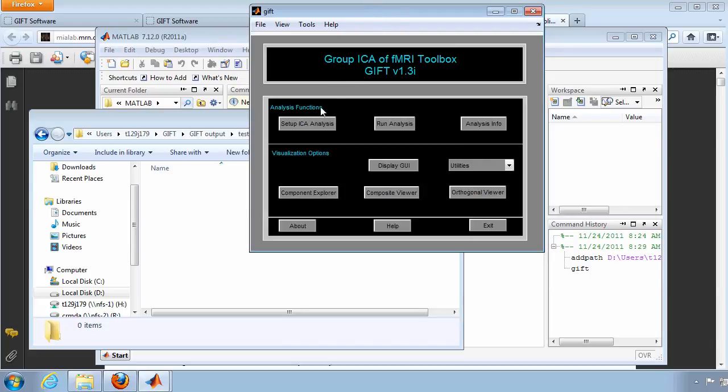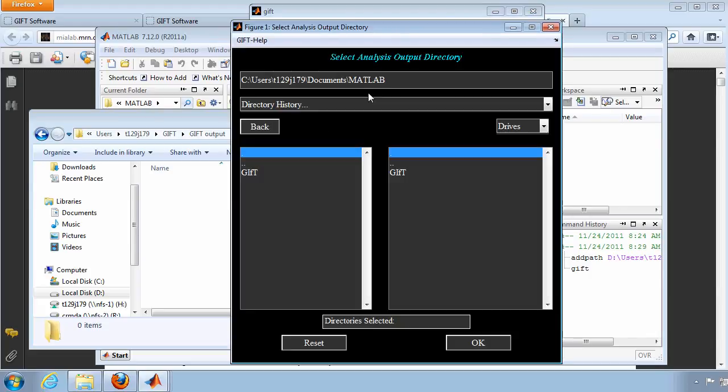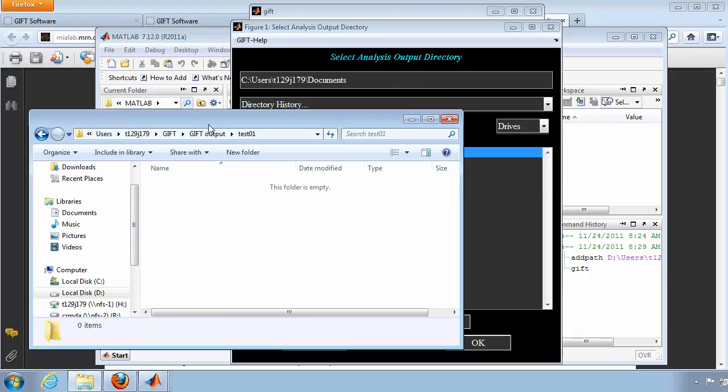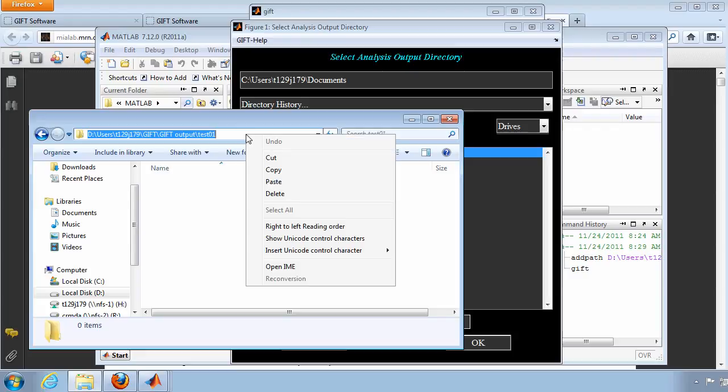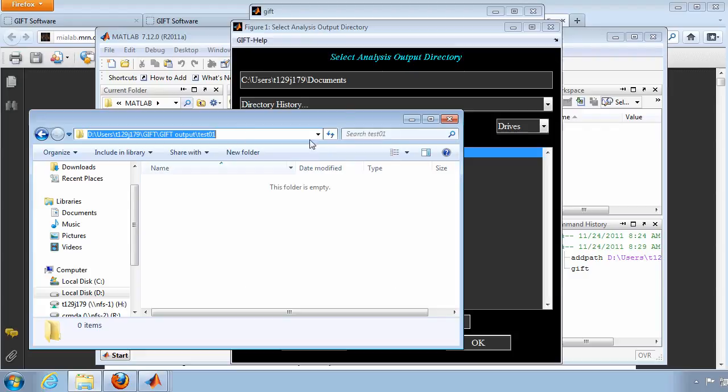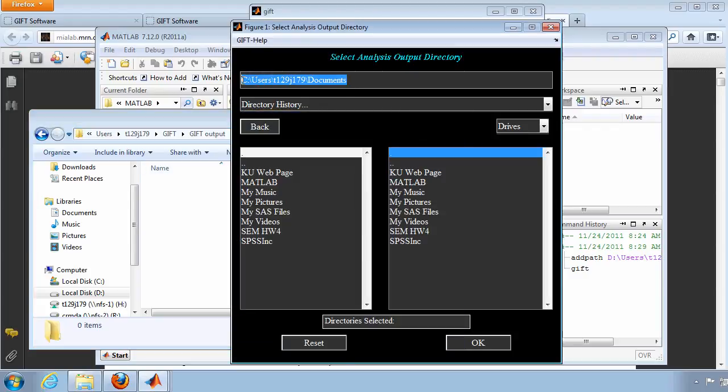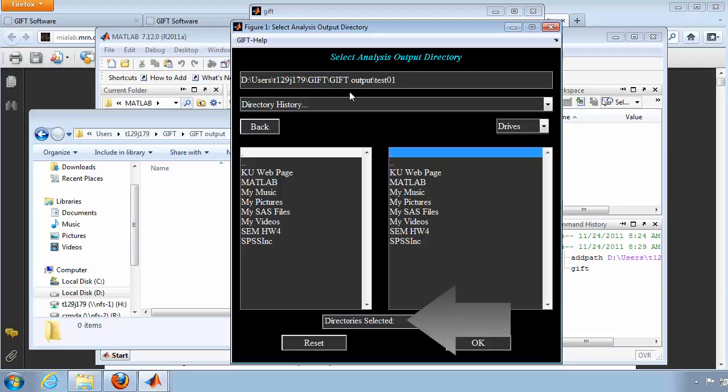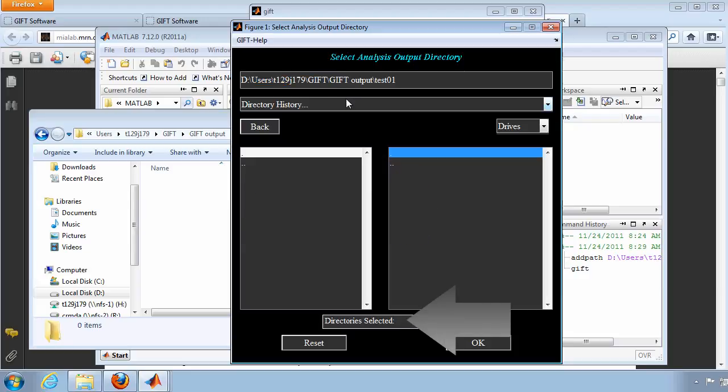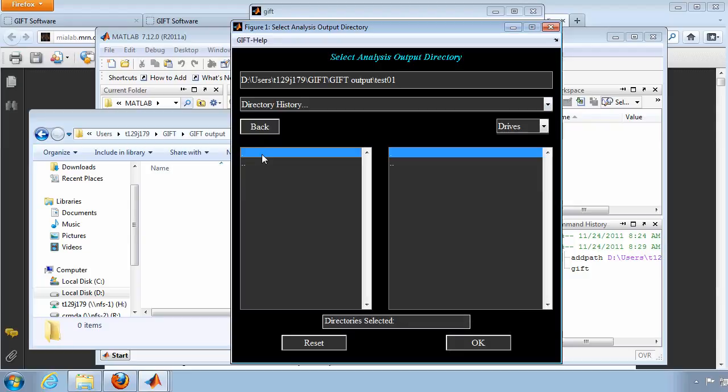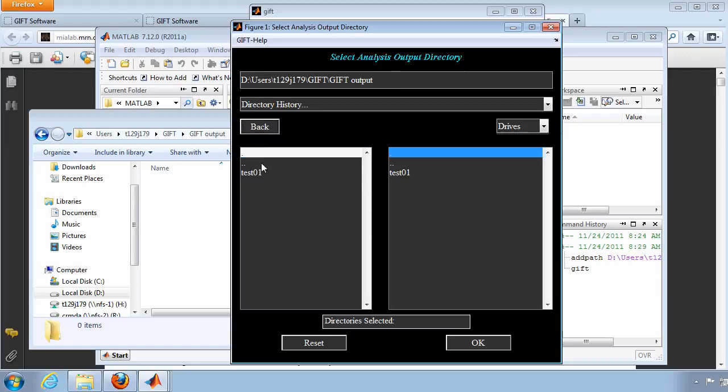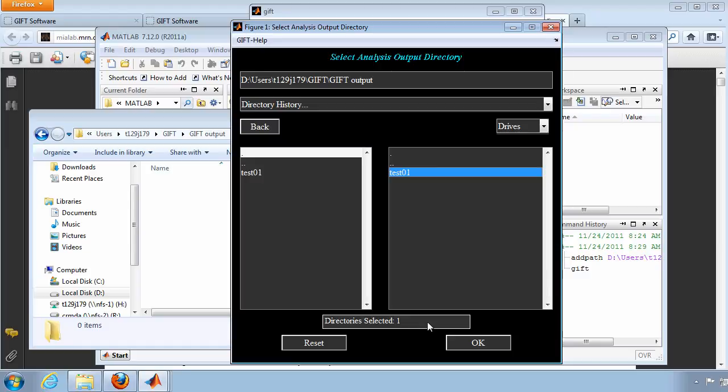In GIFT, click on Setup ICA Analysis, and paste your output directory in the top line. Copy this path name in Windows Explorer so that it will be easy to tell GIFT where to find it. Notice at the bottom that there is still no directory selected. Click back to go to the parent folder, and notice that when you click on the correct folder in the left menu, it takes you right back into that subfolder. In order to actually select this folder, click back and then click on the correct output folder in the right-hand menu. Directories selected now indicates 1, so you can click OK.